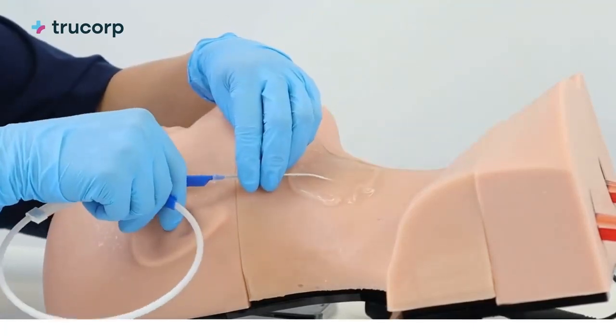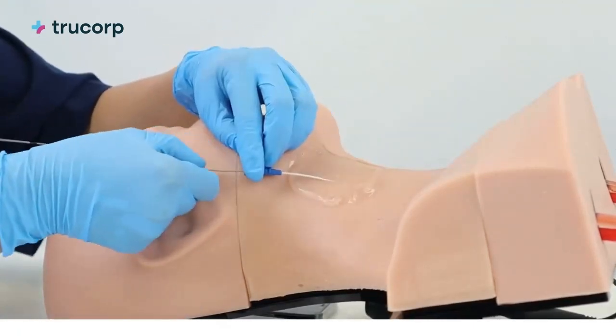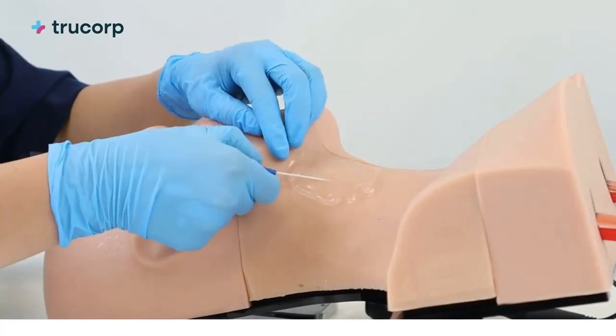The durable TruUltra material showcases a high-quality ultrasound image to provide trainees with a true-to-life ultrasound training solution.